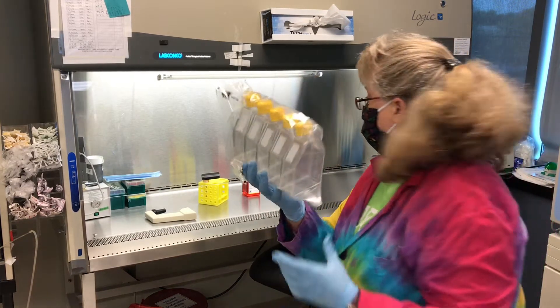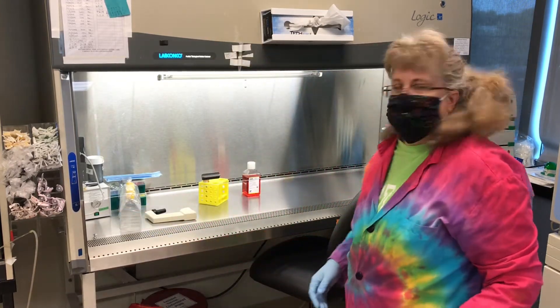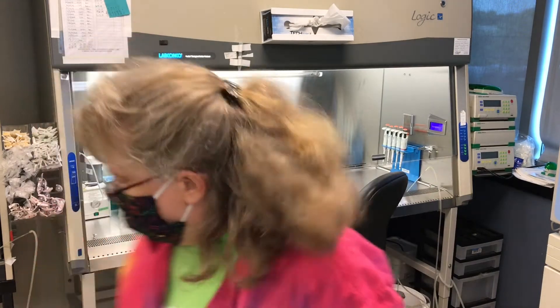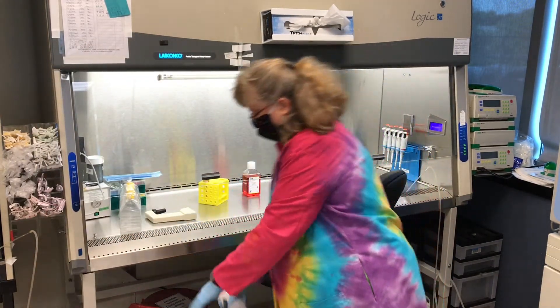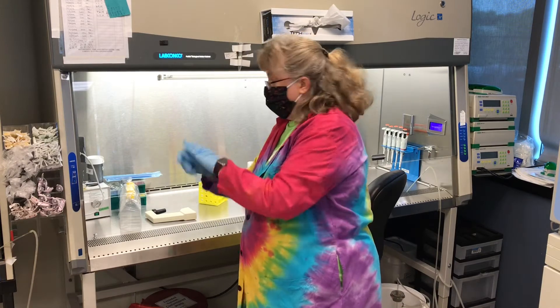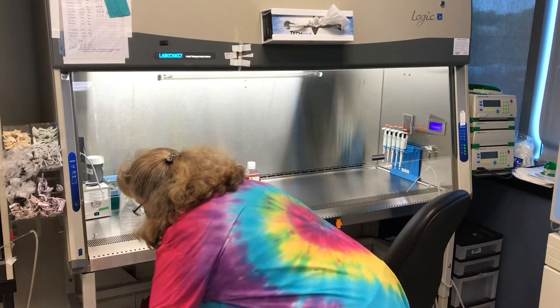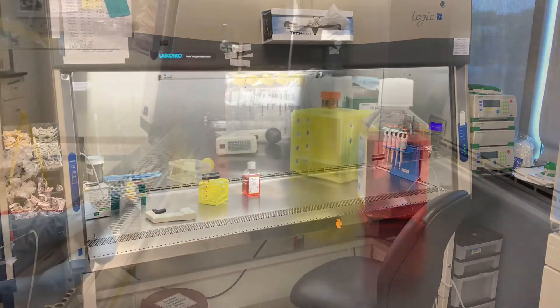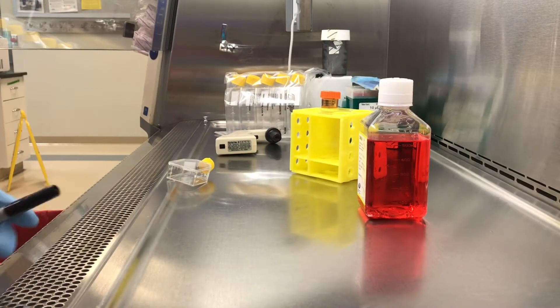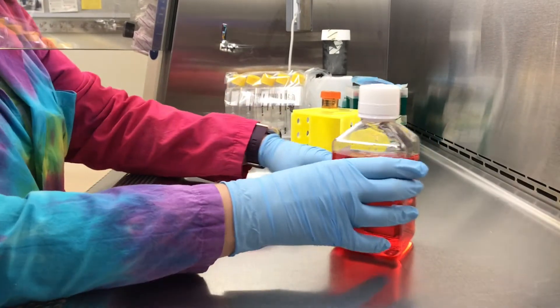Now I'm grabbing some flasks. For the purposes of this class they will be put out for you. The flasks you'll be using are a little bit smaller — those are T75 flasks. Before I hop in the hood and get going, I spray down my hands and get those as sterile as I can.